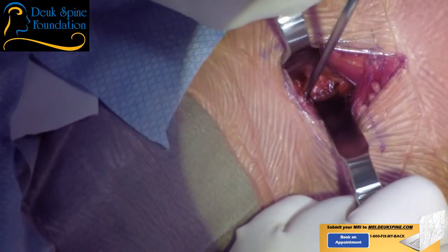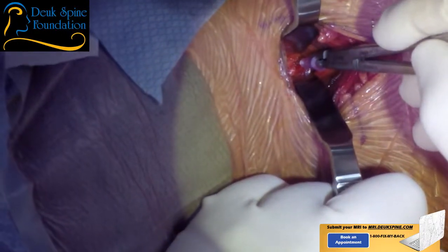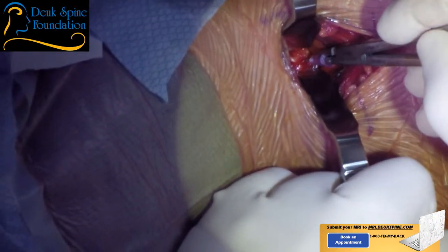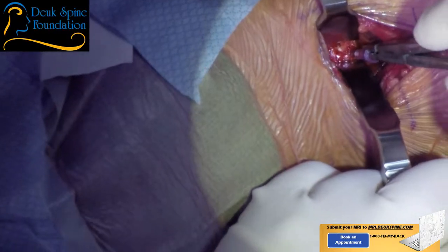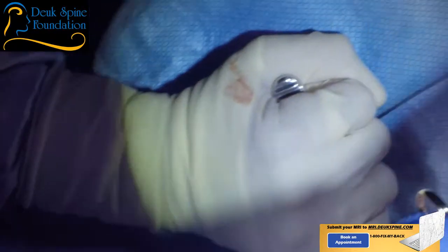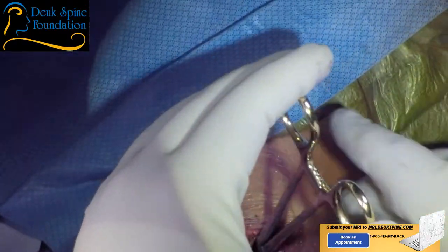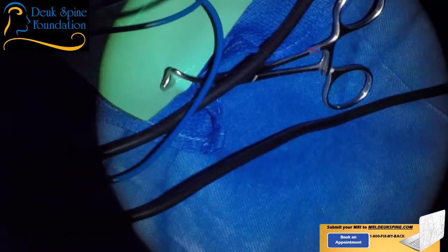I need a localizer. Yeah, I've got to figure out, because I can't see. There we go. That's probably 5-6. So let's take a look. Come on out. Okay. We need to hold this here. He's got like an osteophyte in front of 5-6.